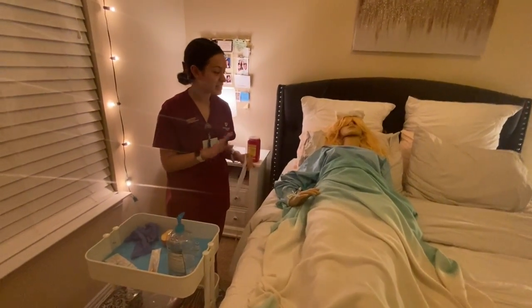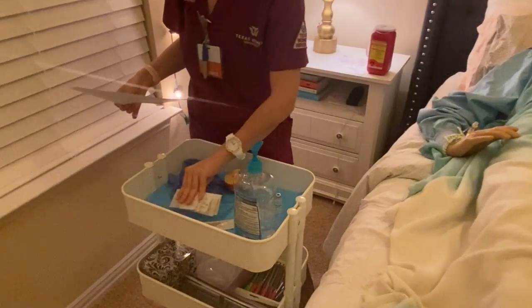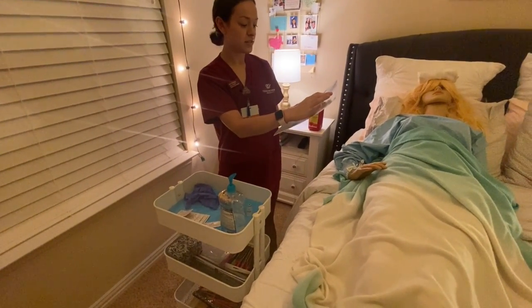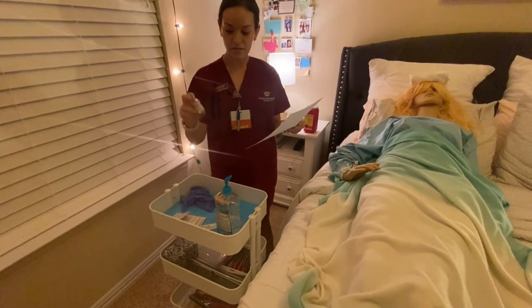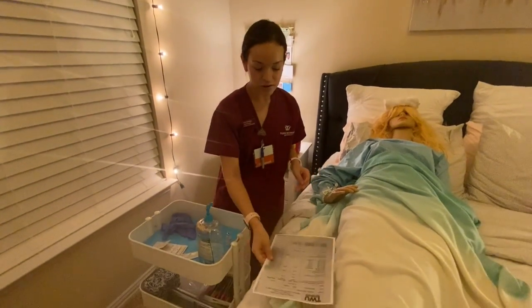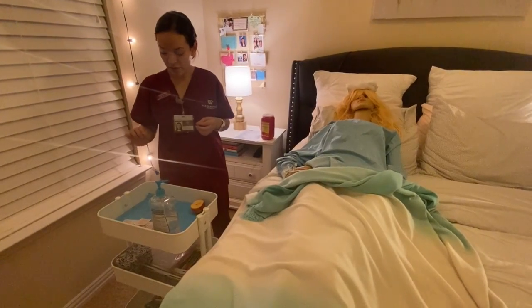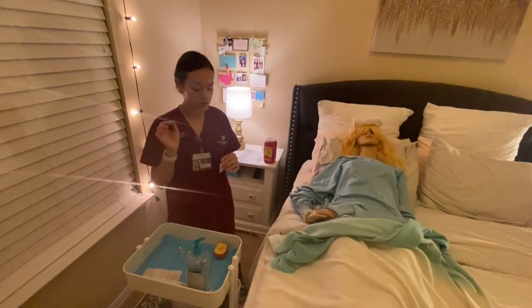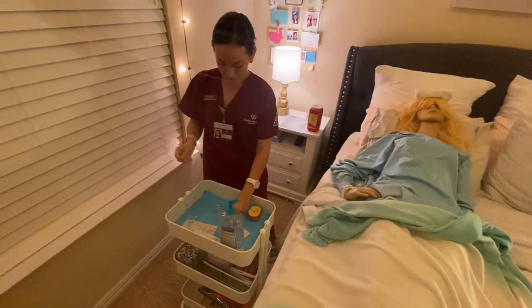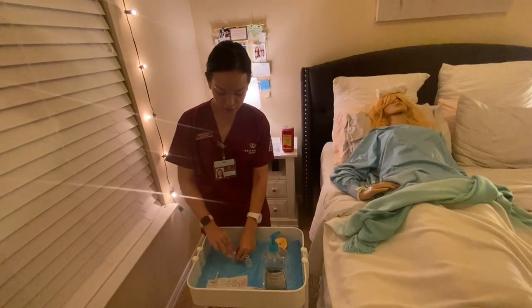So now I'm just going to get the supplies ready and place the order. Have my syringe and my alcohol pads. And I'm just going to match the NPH to make sure it's the right medication. And the regular insulin matches. Okay, great. So now I'm just going to perform hand hygiene again. And I'm going to clean the tops of the vials before I actually insert my syringe. So I'm just going to get the alcohol wipe and clean the tops. Same thing here, making sure the wipe is still wet.